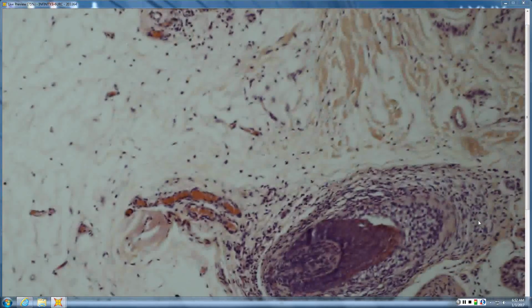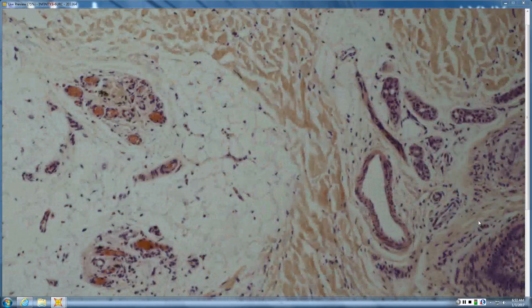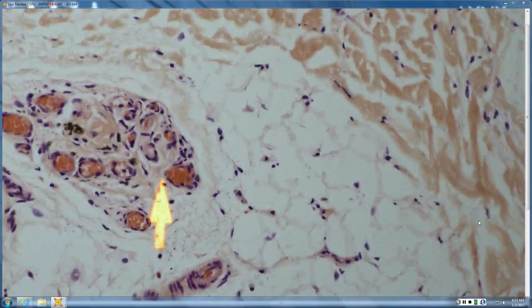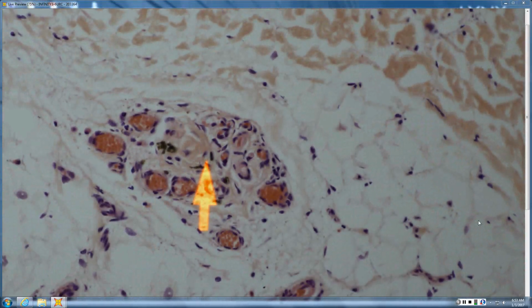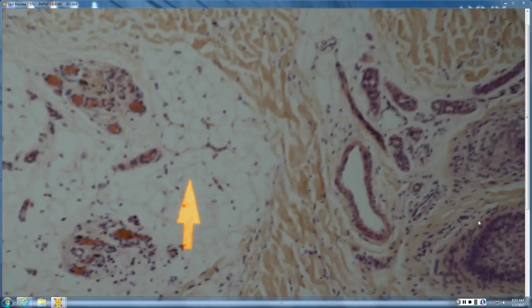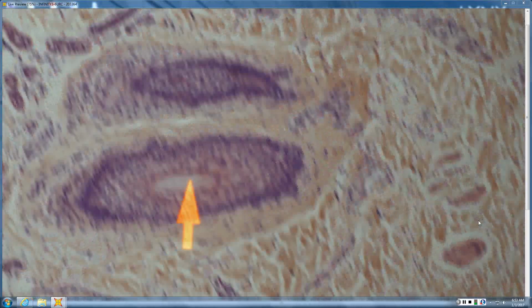If you find a fibrous tract, which I think this is probably the bottom of, just cut out of cross section, at the very bottom here you can see that there's pigment left within the fibrous tract, and that also points toward the abrupt occurrence of alopecia areata. You can see that in other cases of anagen effluvium, and of course also in alopecia areata. Those are really the main features. Again, you may see a little bit more shift towards catagen, telogen hairs, or some miniaturization.